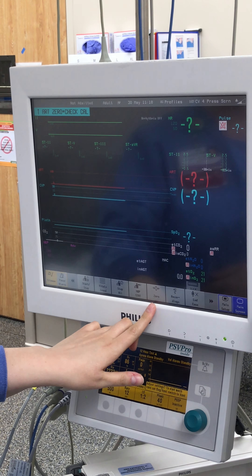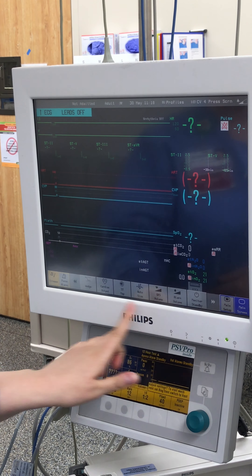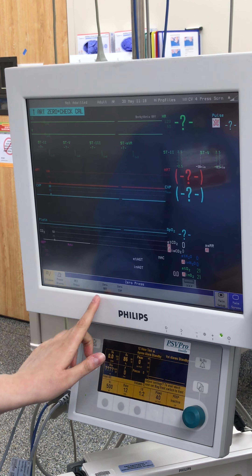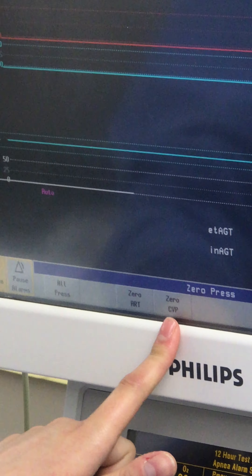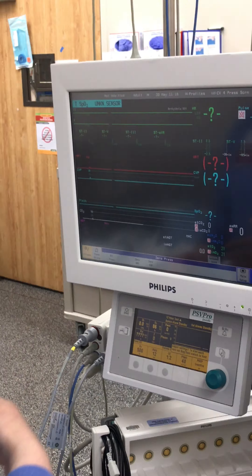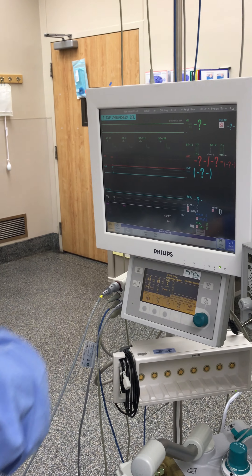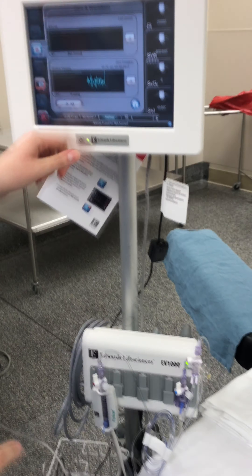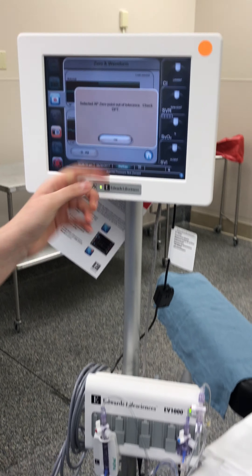I'm going to come down here on this monitor to zero. If it's not on the bar down below, use your little arrows from side to side to get it. You're going to hit zero. It should come up with zero art line and zero CVP if you've hooked it up correctly. So we are going to zero these machines at about the same time — I'm going to press all here. Make sure your stopcocks are turned up, and I'm going to hit it over here as well.